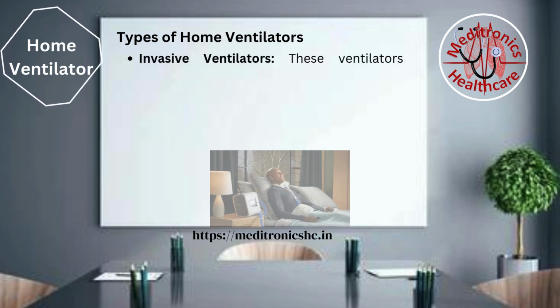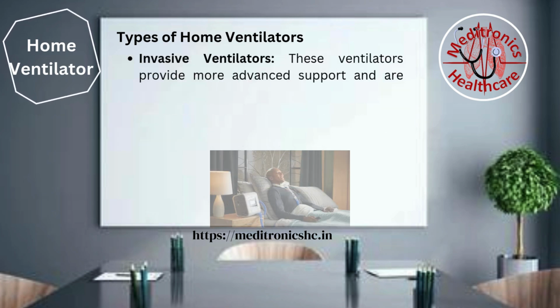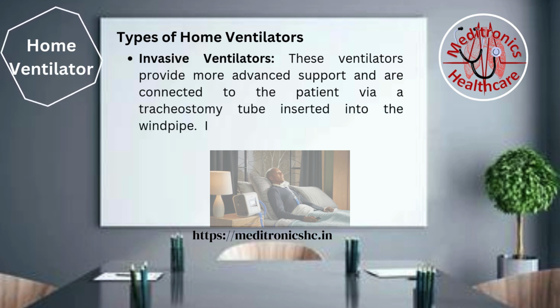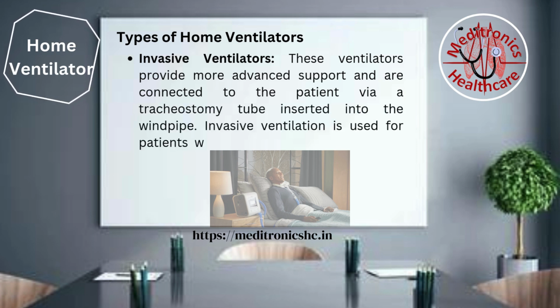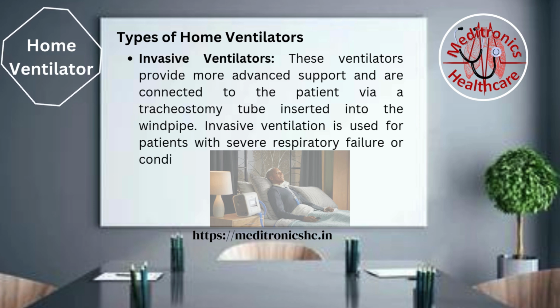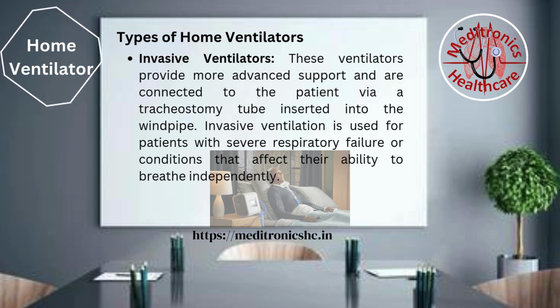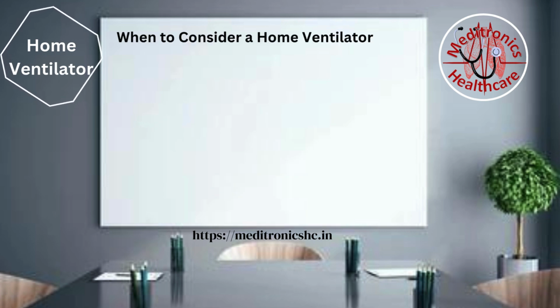Invasive ventilators. These ventilators provide more advanced support and are connected to the patient via a tracheostomy tube inserted into the windpipe. Invasive ventilation is used for patients with severe respiratory failure or conditions that affect their ability to breathe independently.